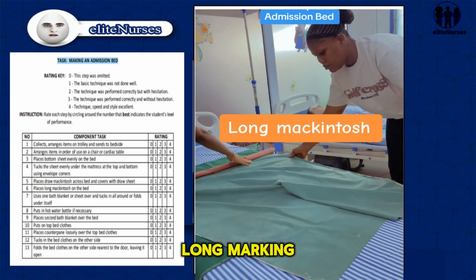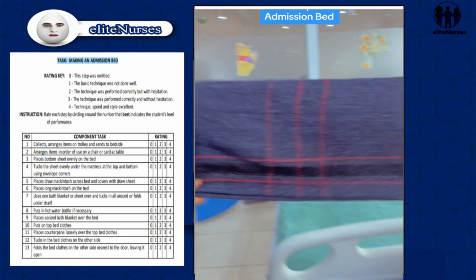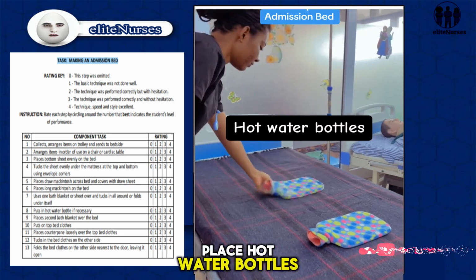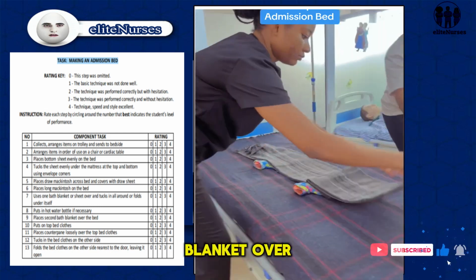Now place the long Macintosh on the bed. Use one bath blanket or sheet over and tuck in all around. Place hot water bottles if necessary. Now place the second bath blanket over the bed.